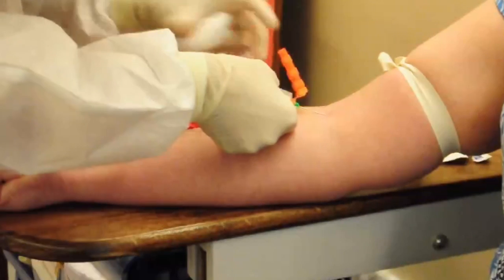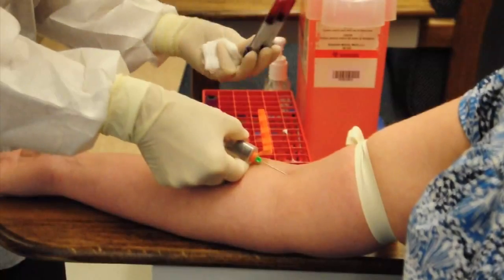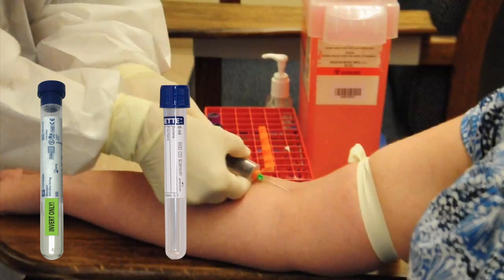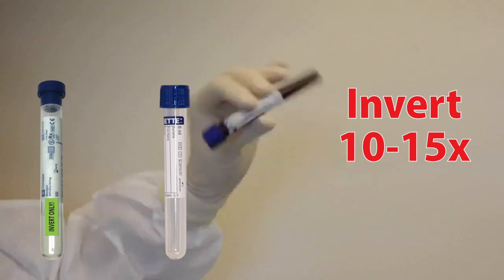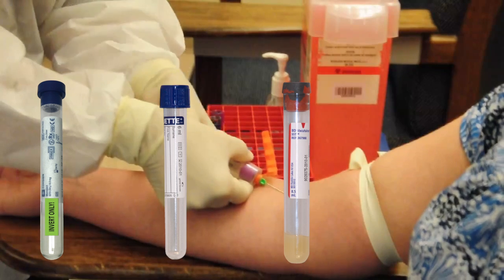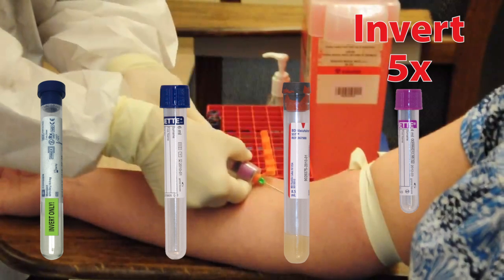Do not use aluminum or other metal crimp rings for drawing blood for the NeutraVal test. Draw blood into the blue top sodium EDTA tube and gently invert 10-15 times. Draw blood into the blue top sodium heparin tube and gently invert 10-15 times. Also draw blood into the red Tiger Top SST. Complete the remainder of the blood draw by collecting blood into the small lavender EDTA tube and gently invert 5 times.